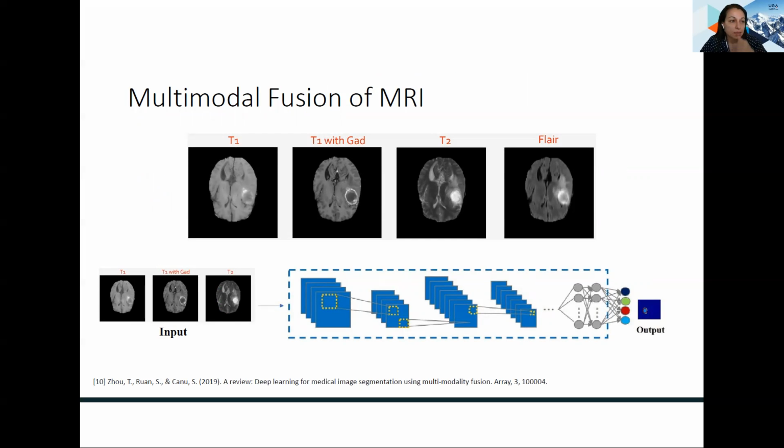Different MRI modalities illustrate different information, and those can be useful for the segmentation. For example, T1 shows healthy tissues with high intensity and the pathology with low intensity. T2, on the other hand, illustrates the pathology with a high intensity response. With T1 with a contrast agent, the tumor border can be visually distinguished by the bright signal of the accumulated contrast agent. In the FLAIR modality, the signal of the water molecules is suppressed, which helps in distinguishing the edema region.